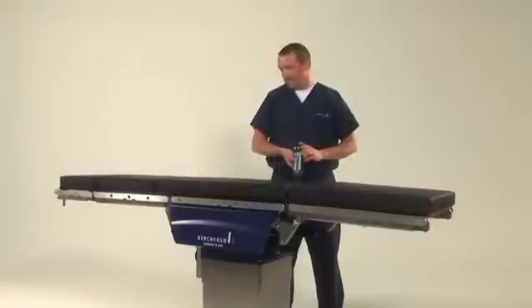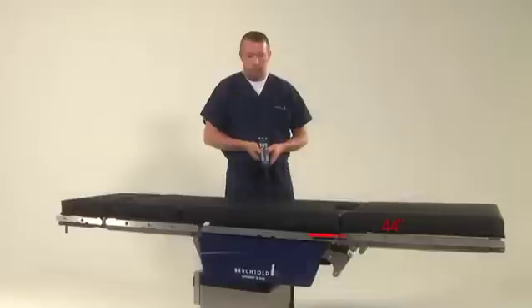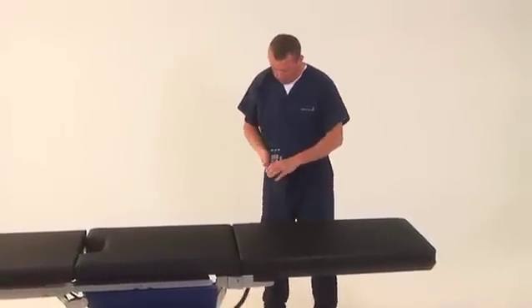The longitudinal slide permits up to 40 inches of upper body imaging and 44 inches of lower body imaging. Additional access is available by using imaging extension accessories.